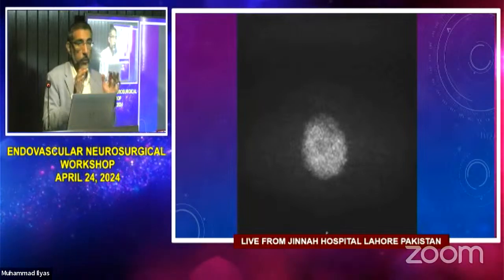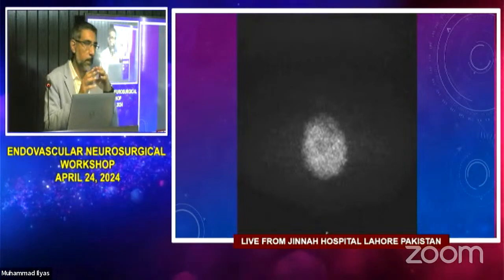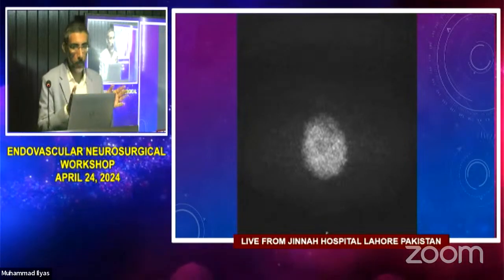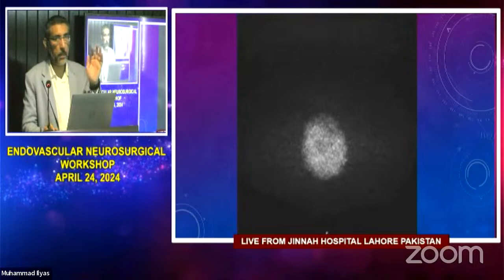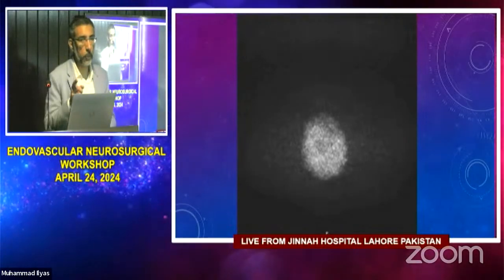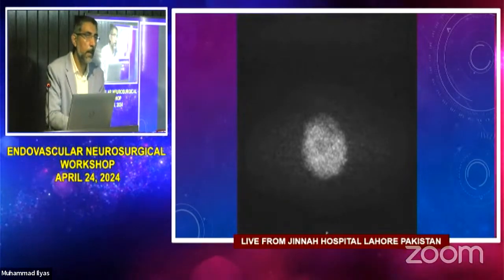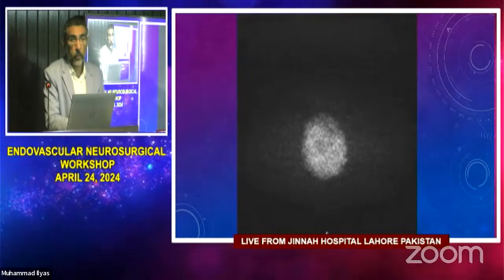So a lot of times we'll just go by the CT scan and see how much infarct has developed. If there's a little bit of infarct in the basal ganglia here and there, we'll take the patient. If the whole hemisphere is just stroked out, with midline shift, then obviously we won't, because reperfusing those people can cause massive hemorrhage, right? Reperfusion hemorrhage. But with CT perfusion, if it's a good study, it will show you a core and the penumbra.